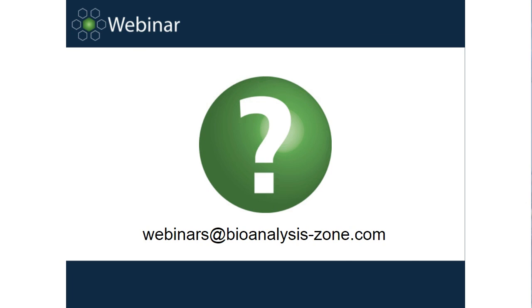And just on the subject of BSA, for any companies that are based in the UK, I would just say there can be issues with shipping material that contains BSA into Europe now with Brexit. That's just something we've noticed. It's only a stabilizing protein to put into your formulation, but because it's animal derived, it can cause some Brexit shipping issues. So if you have an alternative protein, it might be better to put in a non-animal derived one. Sorry, I've gone off on a bit of a tangent there.